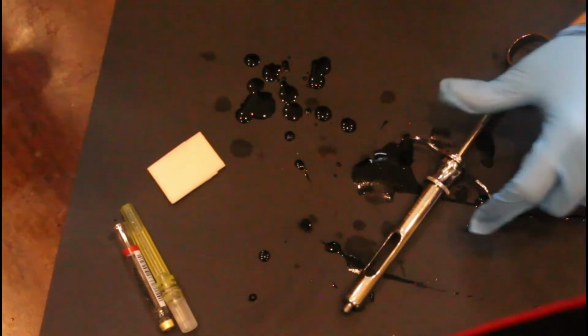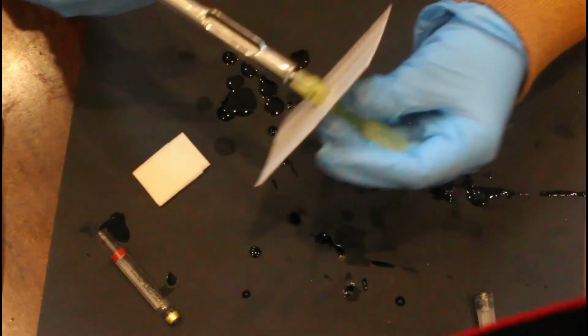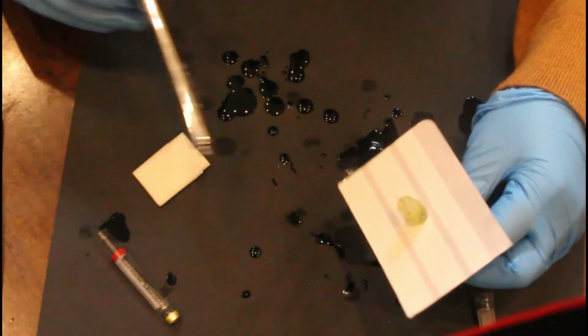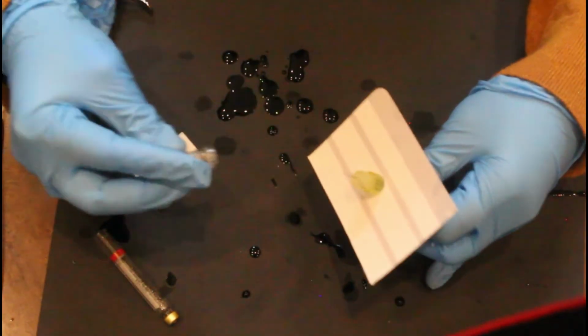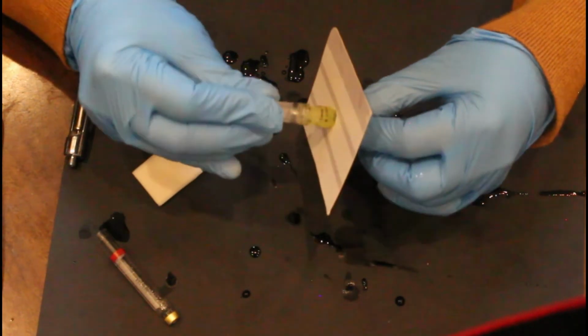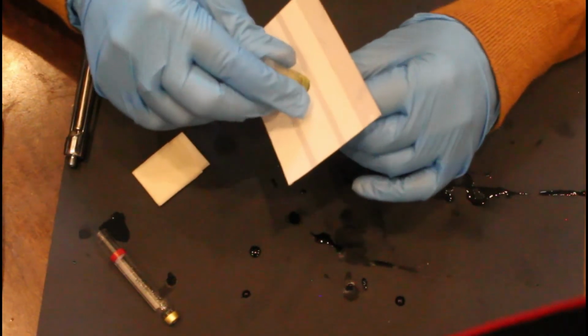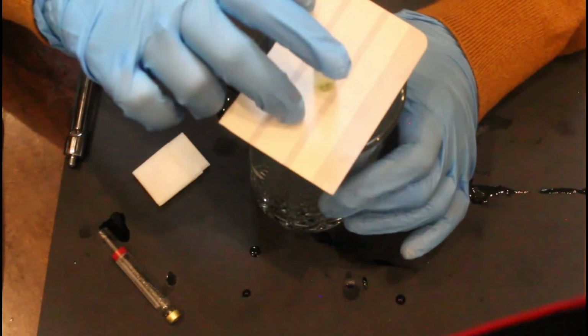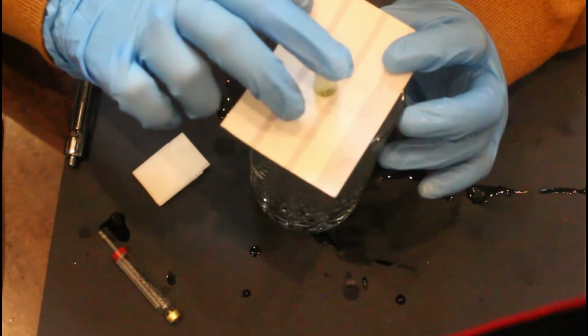When using the protector sheet, unscrew the needle from the syringe and put the small part of the plastic cap back on. Now put this whole assembly upside down into the sharps container. Here I'm using the glass as a sharps container and push this through the hole.